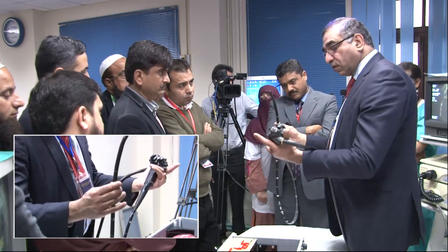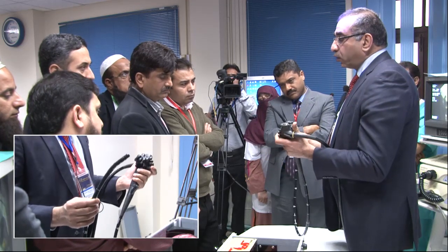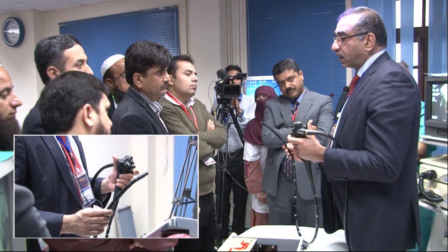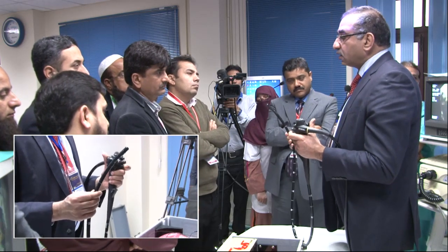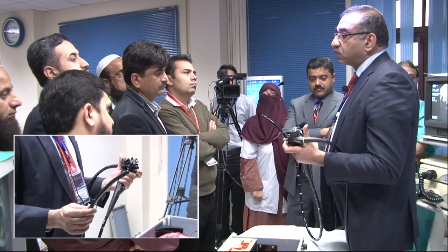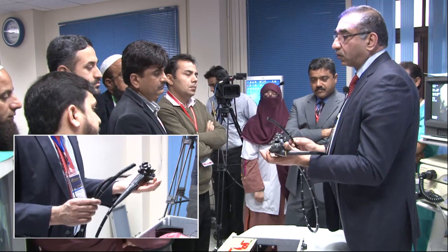So just to familiarize, you normally hold up the scope like that. Always make sure that the patient is comfortable, and one of the ways to ensure comfort is not to inflate the duodenum too much. So do not keep your finger on the inflation button all the time.